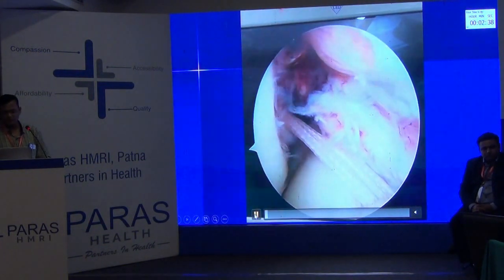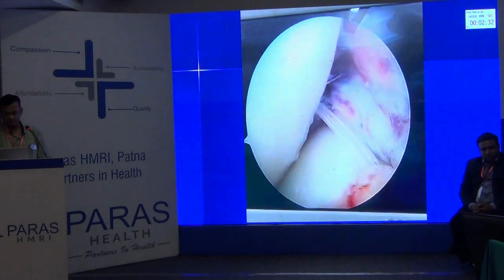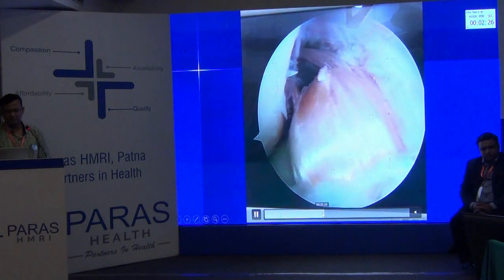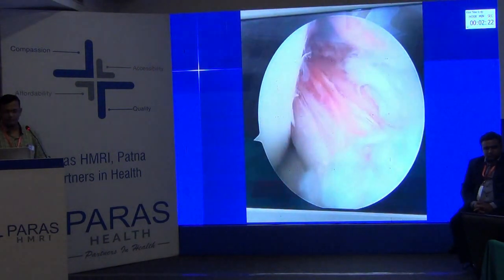And then you should pass your graft. As you can see, the graft is being passed from the tibia to the femur gradually, and the graft is being milked into the tunnel. It's coming out from the tibial tunnel and it's going into the femoral tunnel.